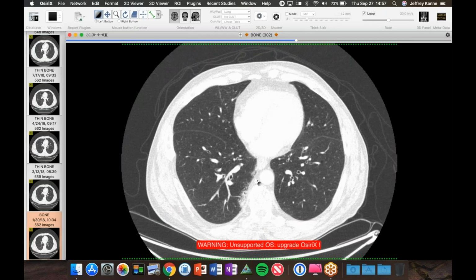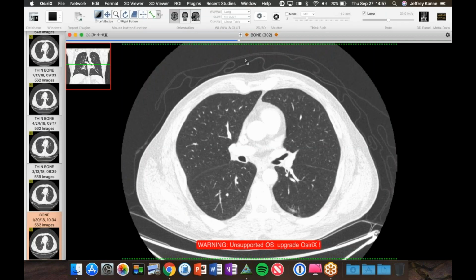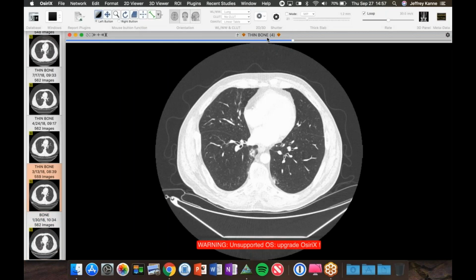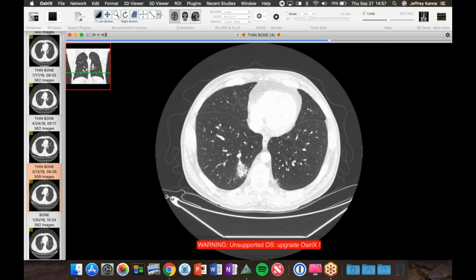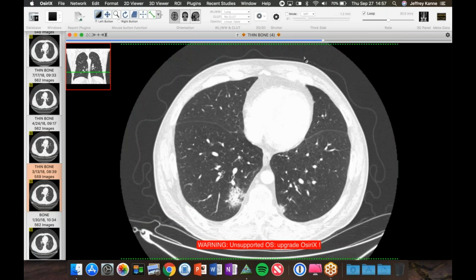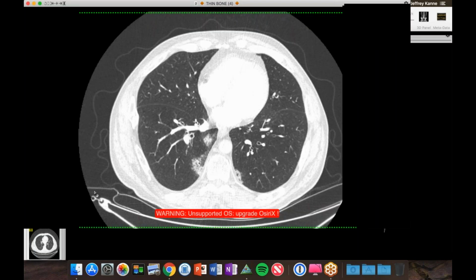So this is January, you can see there's this paraspinal consolidation down in that right lower lobe, and that's about the only finding at that point. Maybe a little touch of it here in the left lower lobe, but it looks like early radiation-induced injury. Now, 2 months later, the patient comes back for surveillance, and we see sort of the typical developing radiation fibrosis, but you'll notice it's starting to come out a little bit more peripheral and more nodular. But early on, that's, I think, not an unexpected finding. It's primarily confined to the area of the spine.